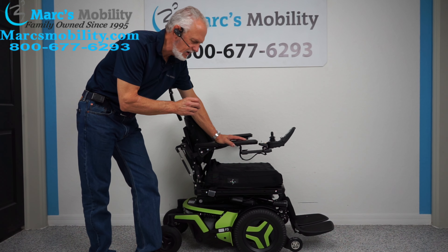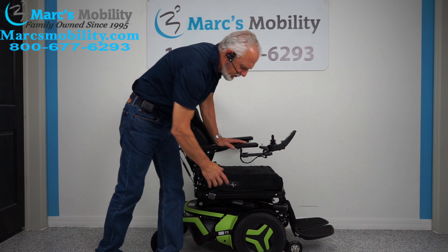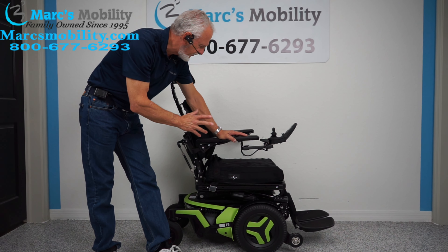Hi, we have here a Permobil F3 — the F stands for front wheel drive — Permobil F3 power chair, neon green, beautiful color.